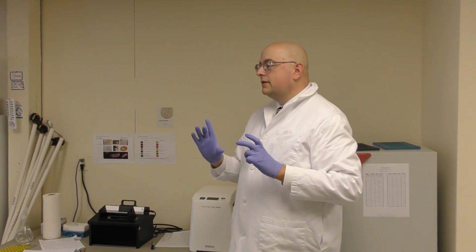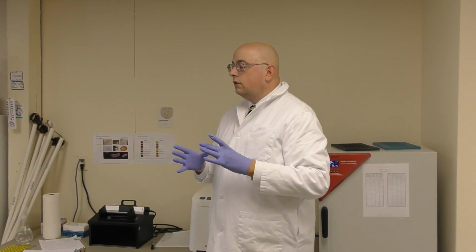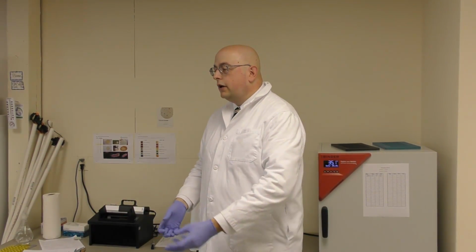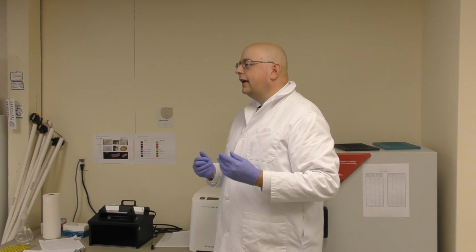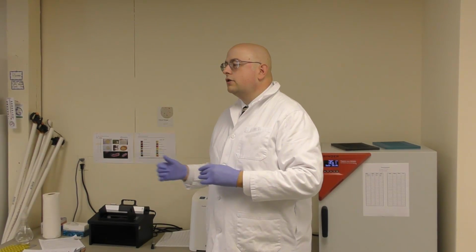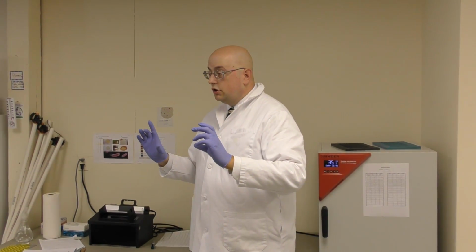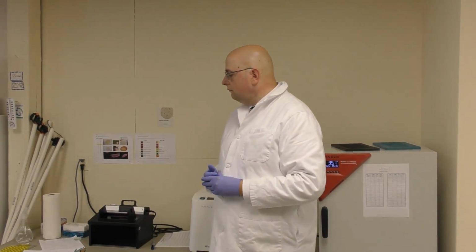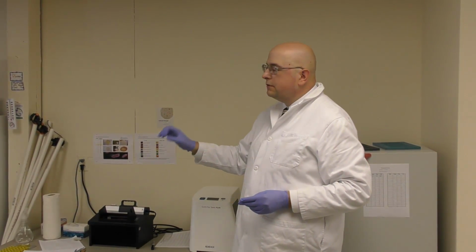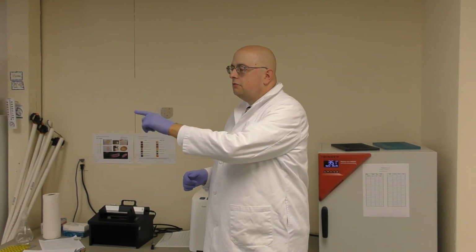What you want to do is, that replicate will determine if you have any variation in your samples. And if you collect them at the same time or very quickly one after the other, it's unlikely that the change you're seeing is due to the environment changing. It may be due more to a technique issue. And you would just process them, and then label those bottles as the station ID and then station ID 1, station ID 2, to let you know that that's your replicate sample.